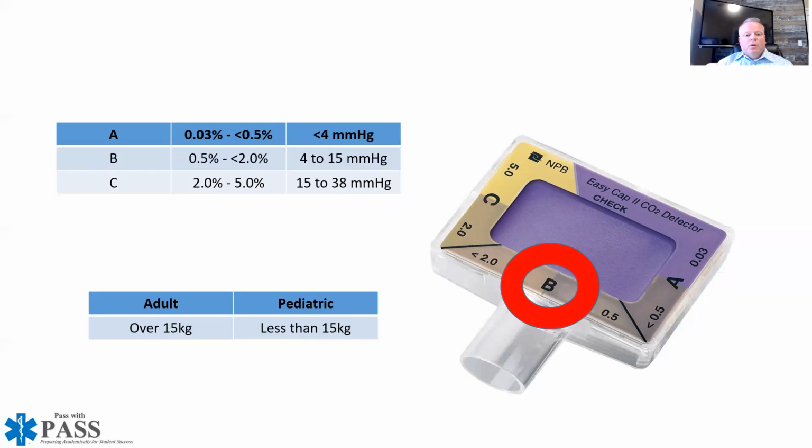So situation, you have a pediatric arrest, unfortunately, you try to find in your bag your pediatric colorimetric device and you're unable to find it. So what do we do? We grab the adult. Don't do that, okay? And there's reasons that we don't want to do that and why these things are made in different sizes. Here's what happens. If I put this adult cap on a pediatric tube, when I ventilate my child, the first breath, oxygen goes through, it goes into the patient. I have good rise and fall of the chest. I know that I'm doing good.